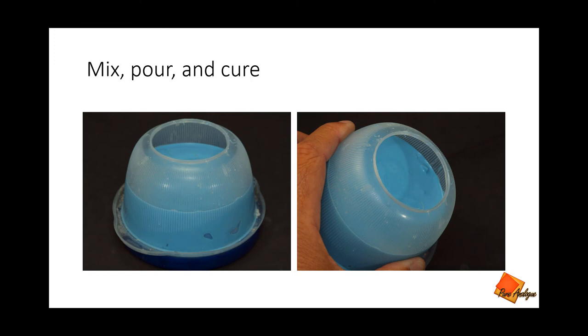Then I mix it up and pour it in, and I am just about 7 or 8 millimeters above the highest point of the tooth. So I have the teeth adequately covered, and I allow this to set up for about 35 minutes. Once it becomes tacky and not going to move when I turn it on edge and touch it with my fingers, it's ready.